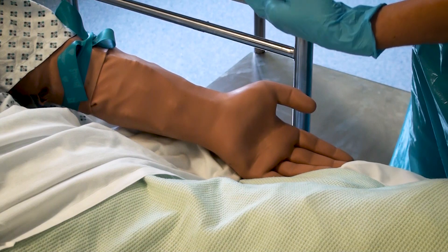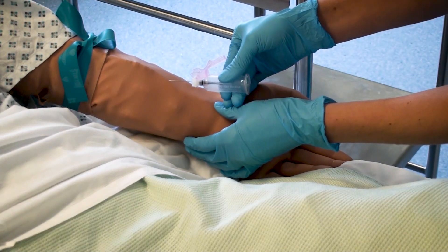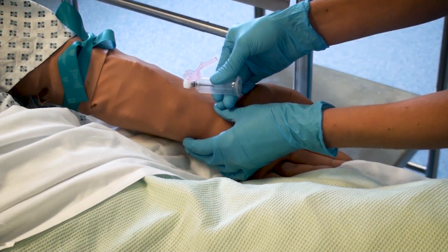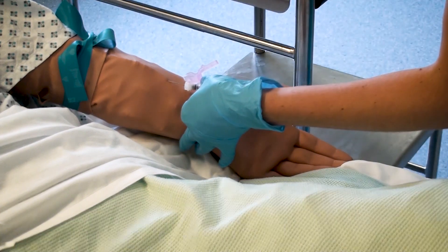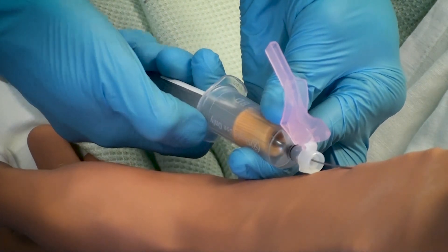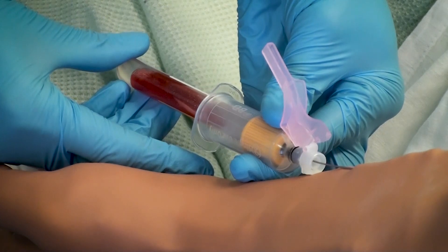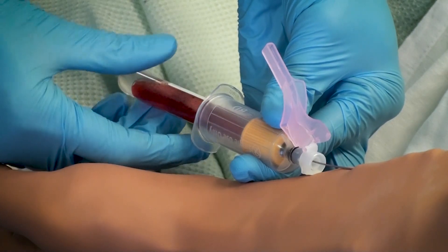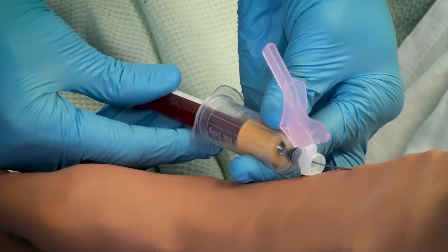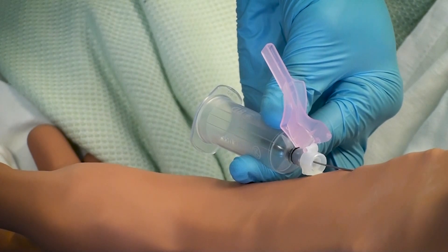Inform the patient that the needle will be inserted and what they are likely to feel. Remove the cover from the needle and insert the needle in line with the vein with the bevel up at an angle no greater than 45 degrees. Maintain the position of the needle whilst inserting the blood tube, then wait for a sufficient amount of time for the tube to fully fill. Remove the tube whilst retaining the position of the needle and replace with the second tube as necessary.